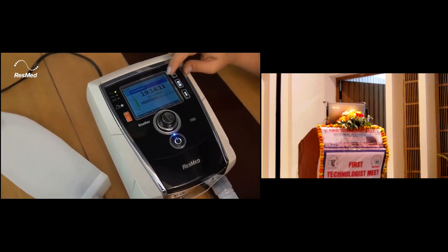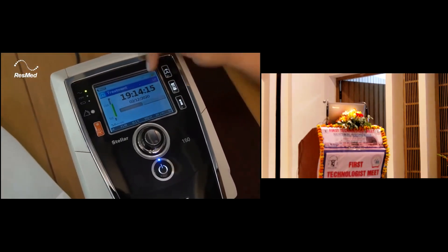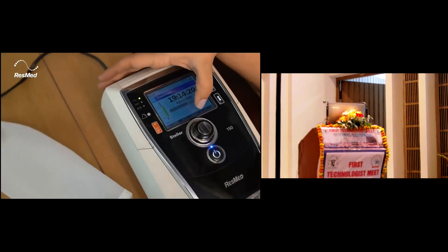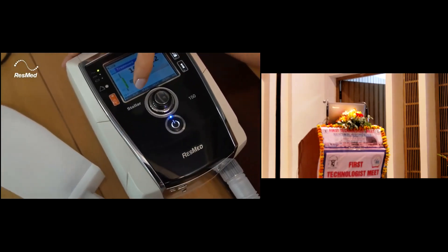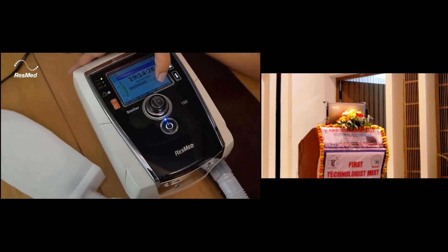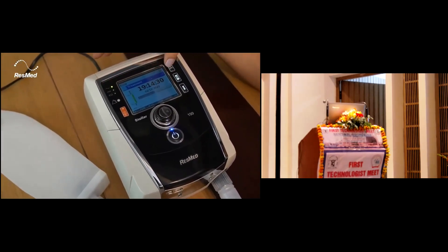Coming to the monitoring menu, you have 1 out of 8 pages. In the first page, you can see not only the pressure bar but also in the bottom bar, you can see the leak, the RR, the TI, the VT, and the MV at all times. As we go from one monitoring display to the other, there are 8 displays.